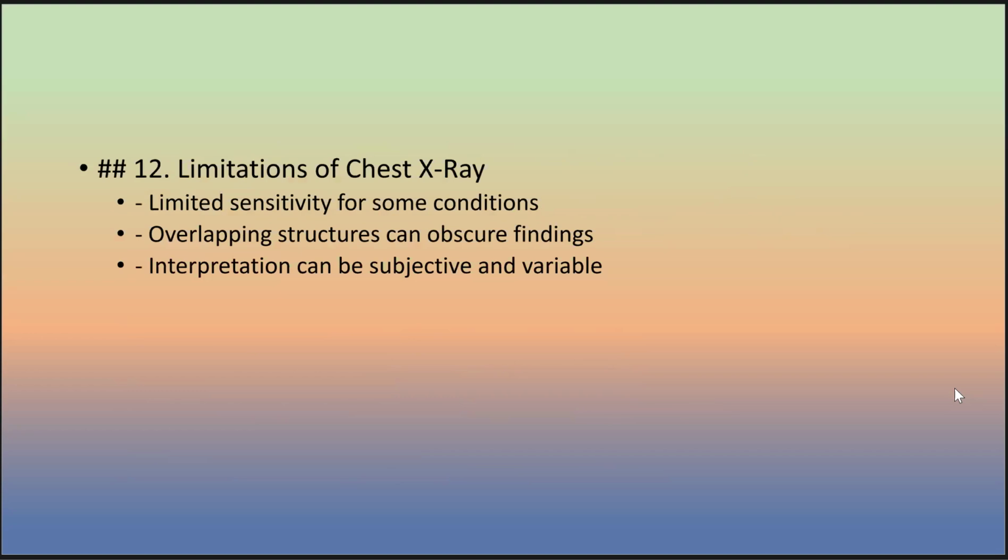The limitations of the chest X-ray: it has limited sensitivity for some conditions. Overlapping structures can obscure findings. Interpretation can be subjective and variable.